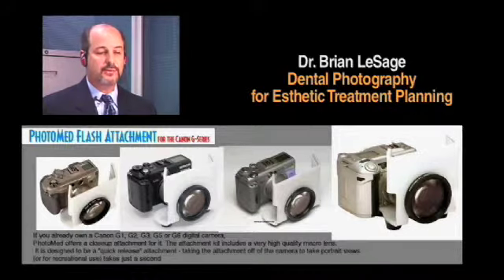Certainly we all need to come up with a budget. You're talking about a minimum of $1,000 to get into a nice digital camera, and then up to about $3,000. So think about your budget, but also think about the long term, because you're going to save a lot of money on buying film and the processing of film. It's very expensive. So those are really the two parameters I'd like you to think about on the digital cameras.